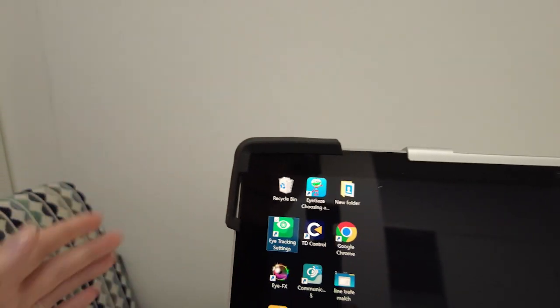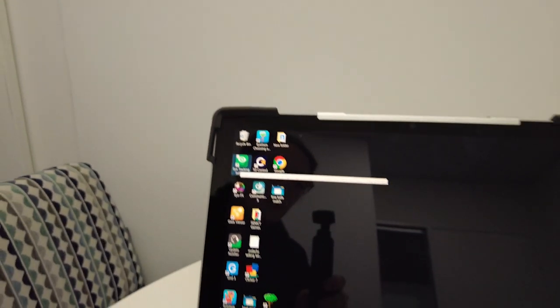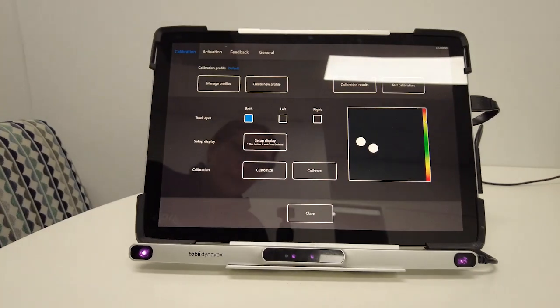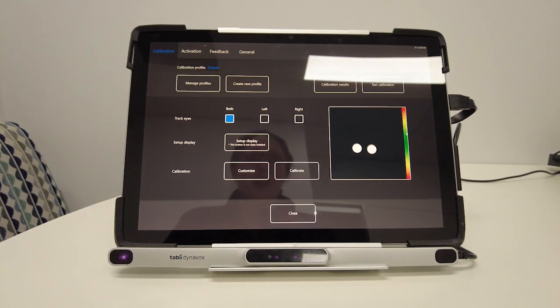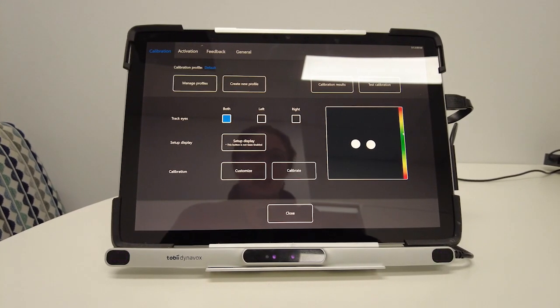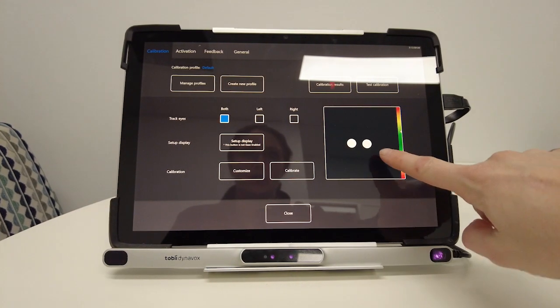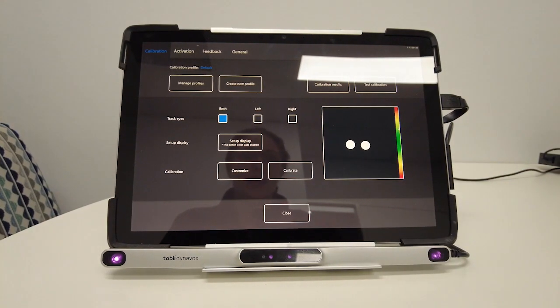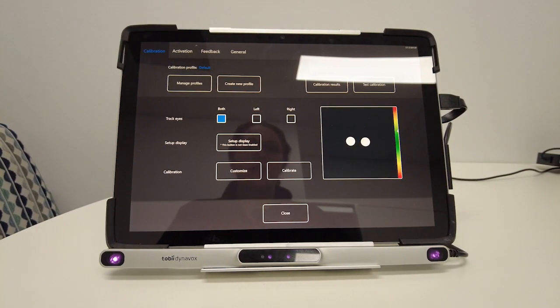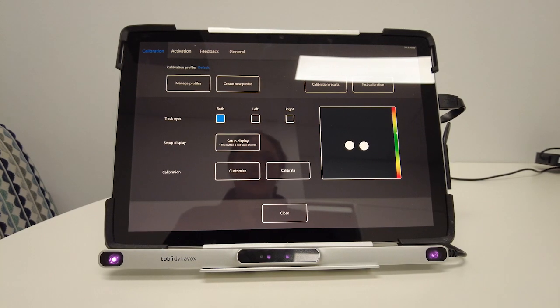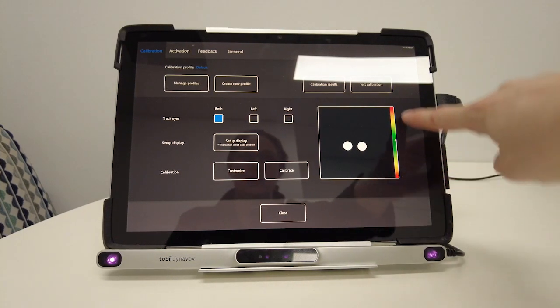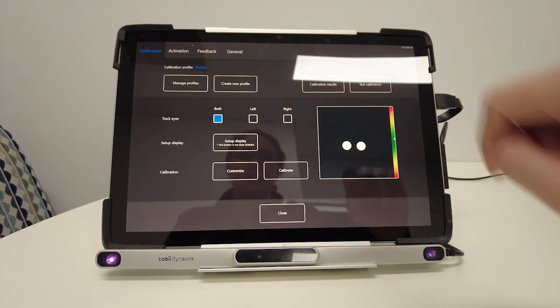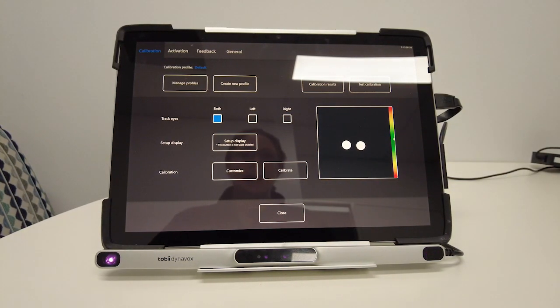I'm going to double tap to open. Okay and you can see now my eyes are appearing in that track status box on the right hand side. I want them to be centred and I want that arrow in the coloured band on the side to be in the middle.